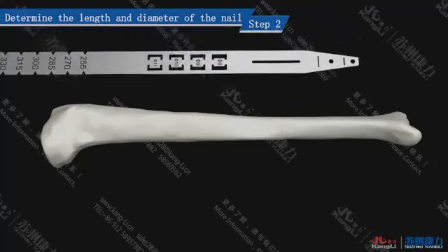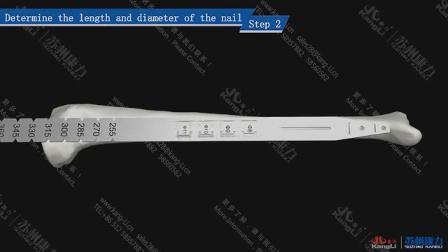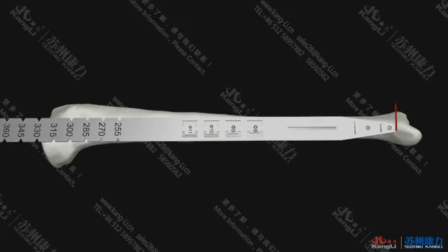Step 2. Determine the length and diameter of the nail. Length selection. Place the developing gauge by the side of the tibia, with the proximal side at the nail entrance point and the distal side at the tibial dome. Then directly read out the length.